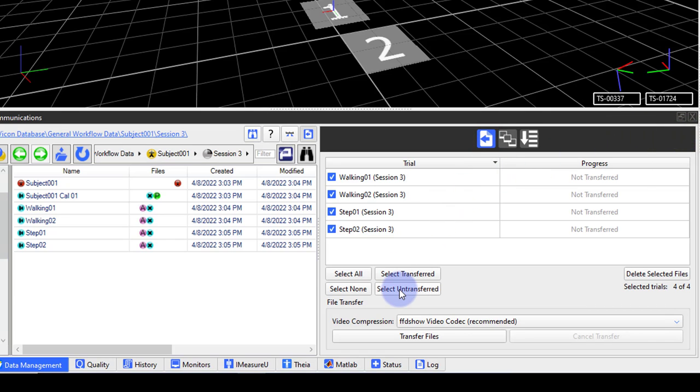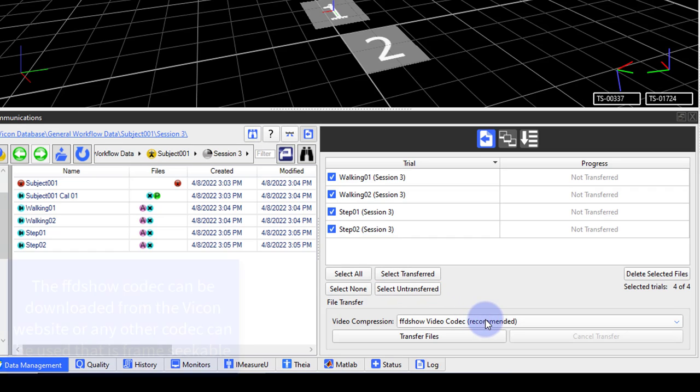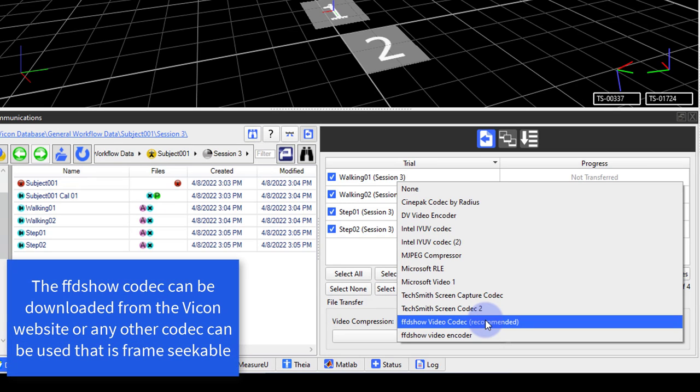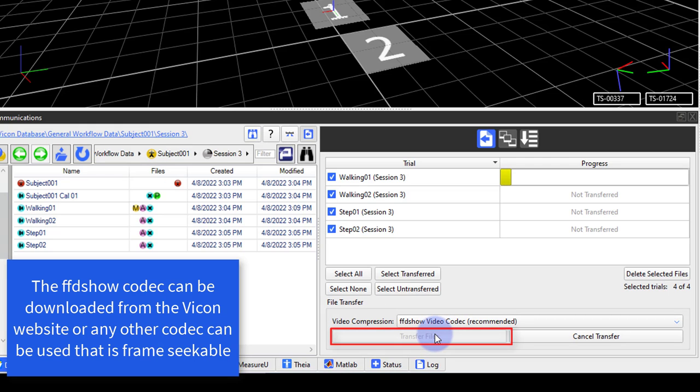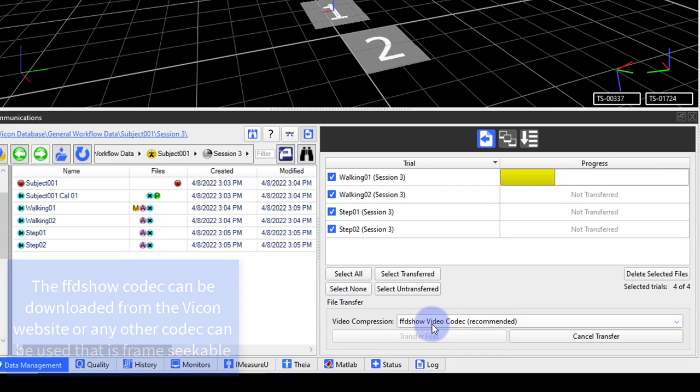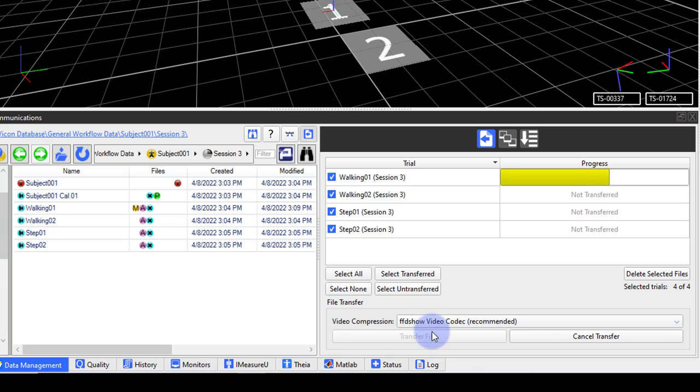I can see the list of trials with video files still on the video drive. I can click the select untransferred button, which will select all the trials that have not yet been transferred. I will choose my preferred video compression and then click transfer files.